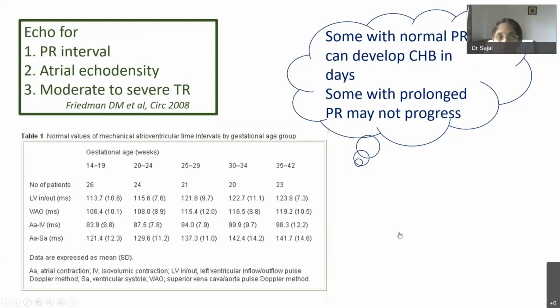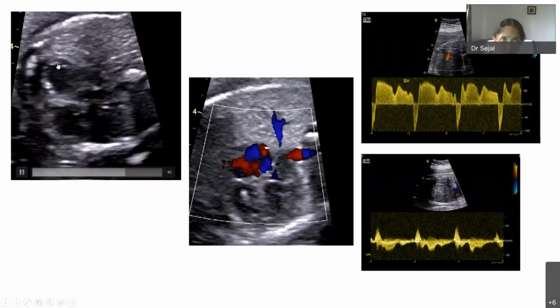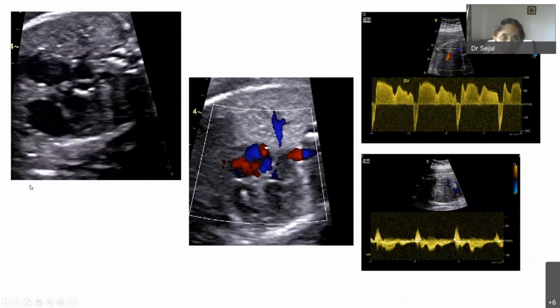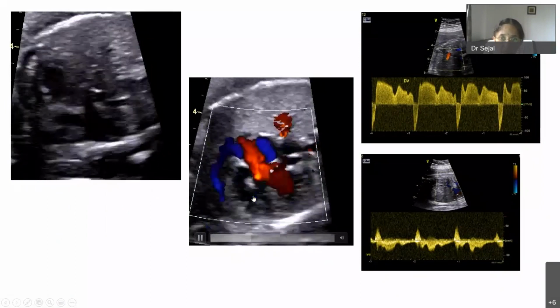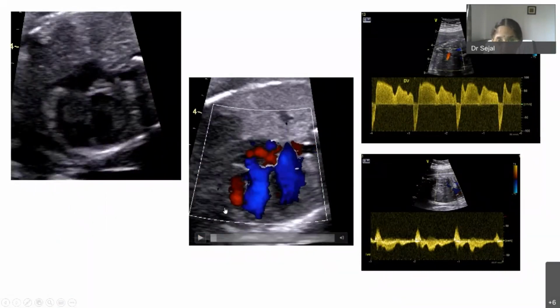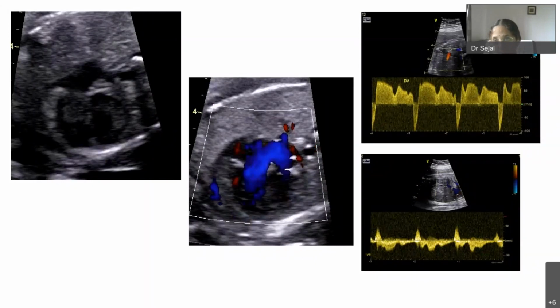Here you can see the first video is a 2D, and it's very obvious. The atrial appendage is contracting much more compared to the ventricle, and the rates are obviously very, very slow. Subjectively, you can pick up that this is definitely a pathological bradycardia. Try to look for AV valve regurgitation; in the tricuspid and the mitral, you have biventricular regurgitation. This could be related to myocardial involvement in terms of inflammation, or it could be a reflection of cardiomegaly, AV valve regurgitation, and development of hydrops.